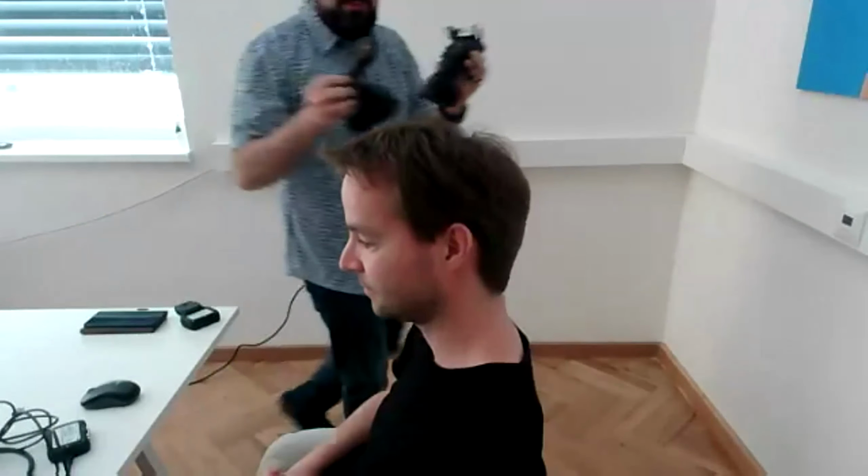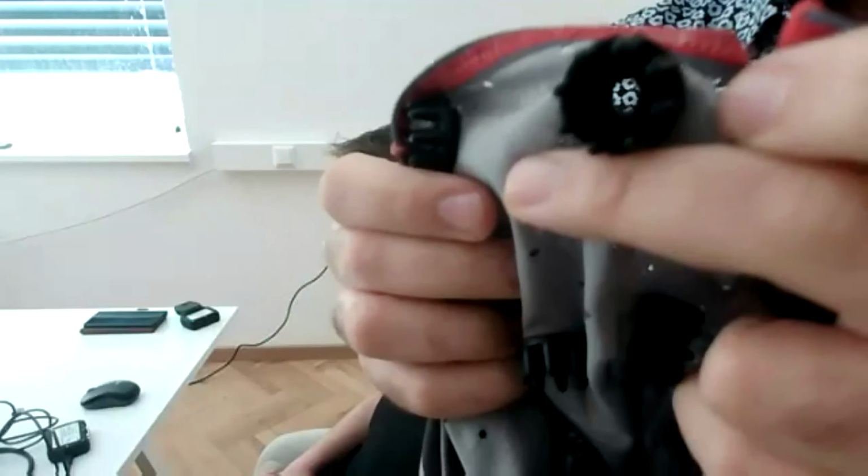And we have here today 2 different caps. We will start first with the cap of the hybrid electrodes. So you can see g.SAHARA hybrid, which is something that you also saw on the Unicorn.